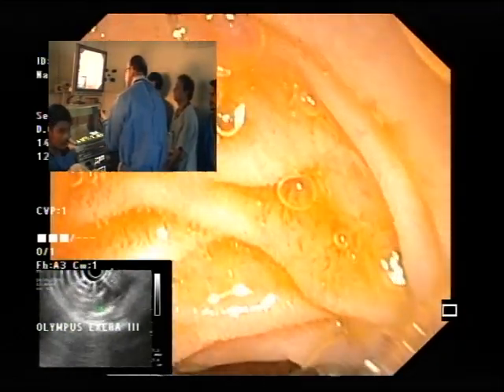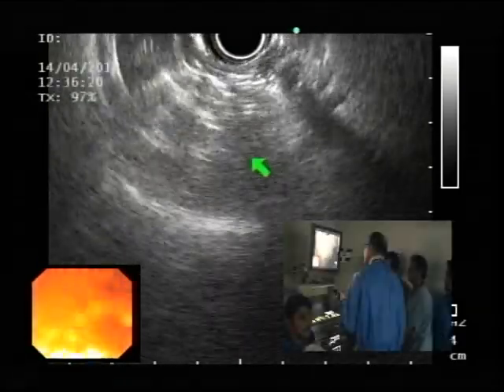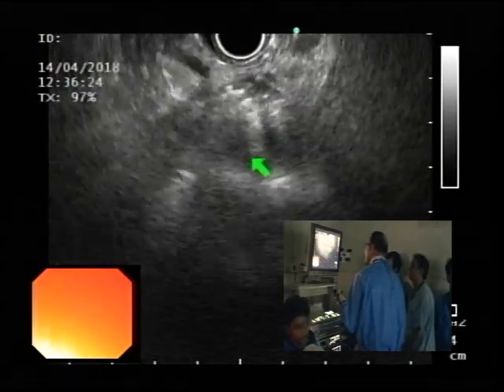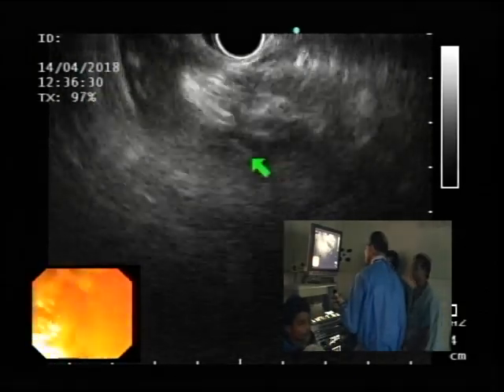And then I will do big wheel thumb down, big wheel up, as I call it, but thumb down, and get apposition against the duodenal wall. Switch to ultrasound. Typically, this will bring me below the papilla because the probe, as Khalid pointed out, is distal. So this is that third portion view where you have the aorta. Or gently pull back and go counterclockwise and clockwise.